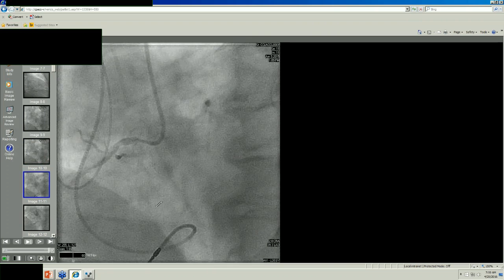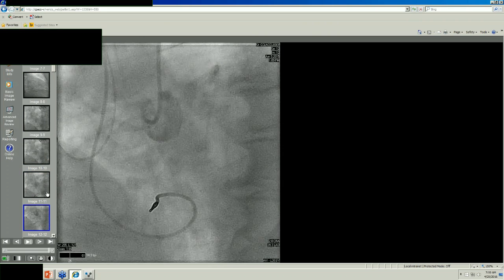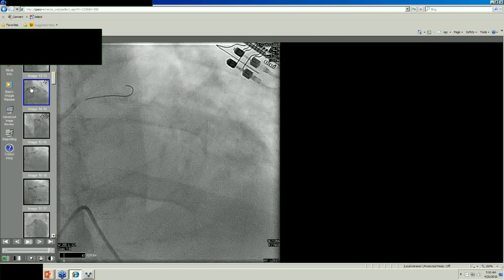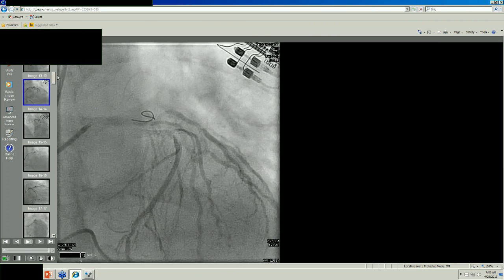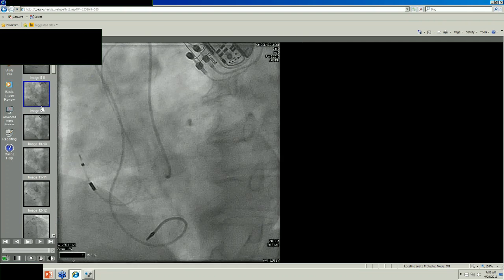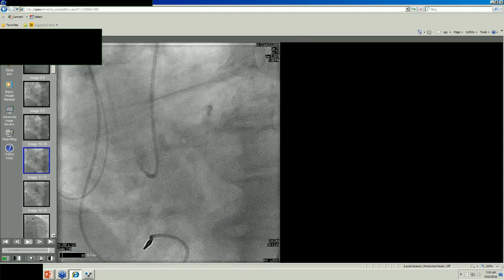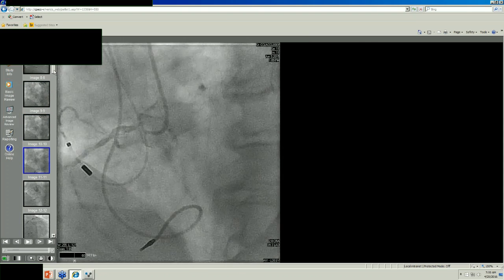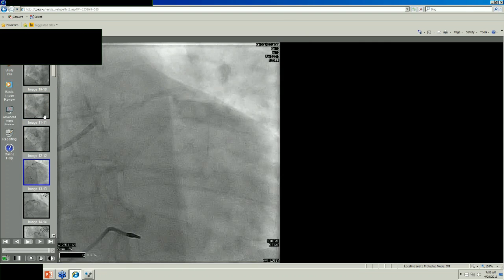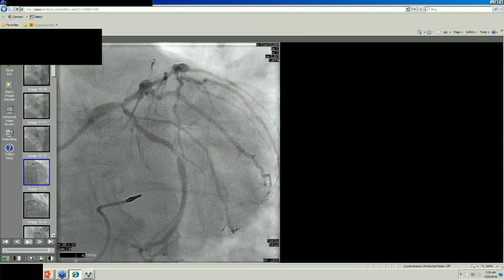And then we're trying to get in the right coronary there, and just sort of being jolted around a little bit. Whoops. Looks like we're getting an angioplasty done. I don't think we ever saw the right coronary. No, never saw the right coronary. But nevertheless, moving right along. Who cares about the right, right? Let's go take a look at the money shot.